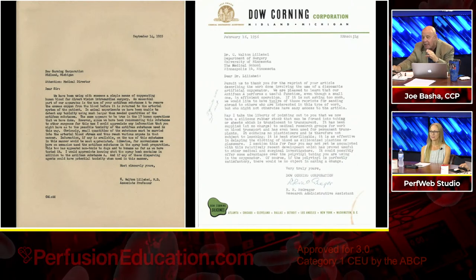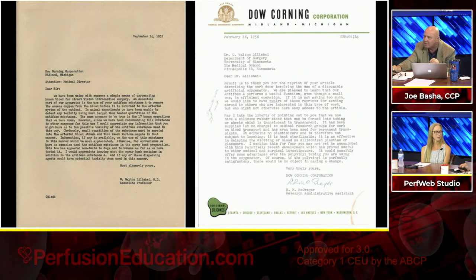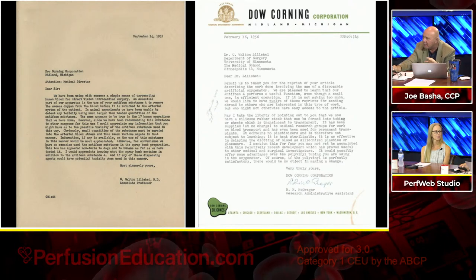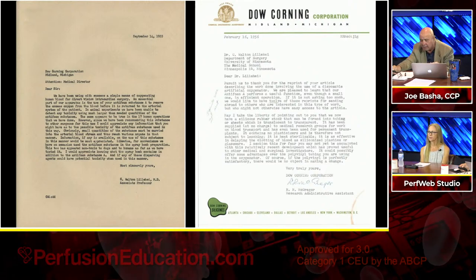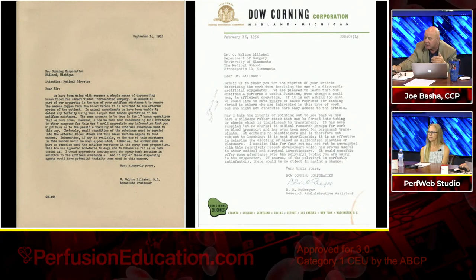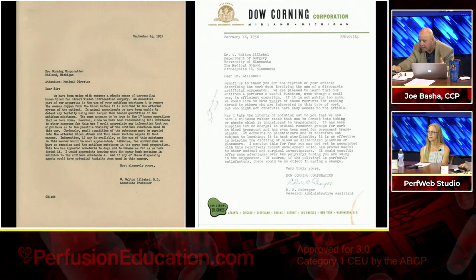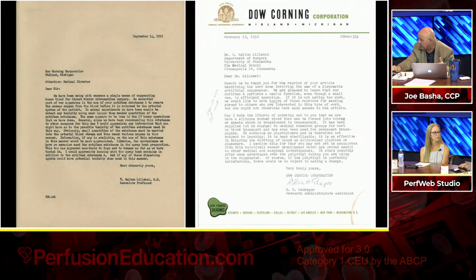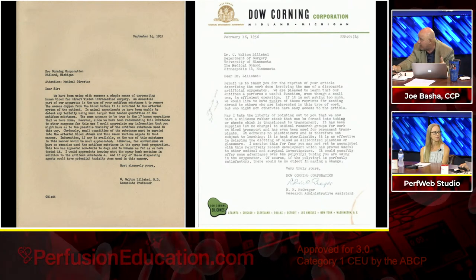Now, the letter back from Dow Corning, I am pretty sure, is not directly answering that question, though the time frame is similar enough that it makes you wonder. And he's congratulating Dr. Lillehei on their progress, and that he's really happy that their Dow Corning Anti-Foam A is working out so well. And oh, by the way, we've got some new stuff out there, tubing and things. So that may be beneficial and less traumatic to the blood.